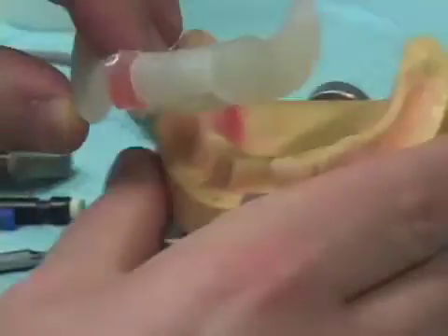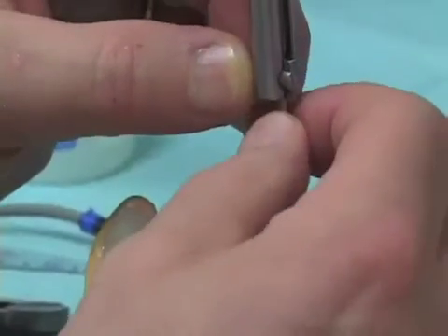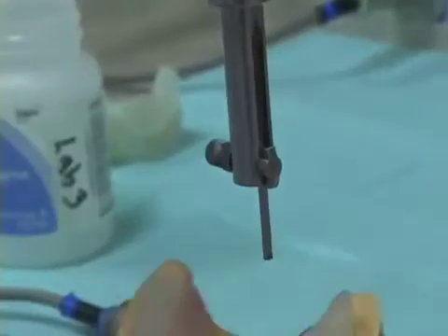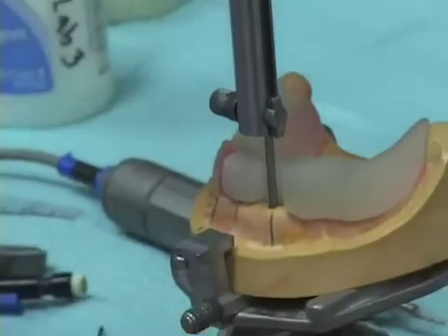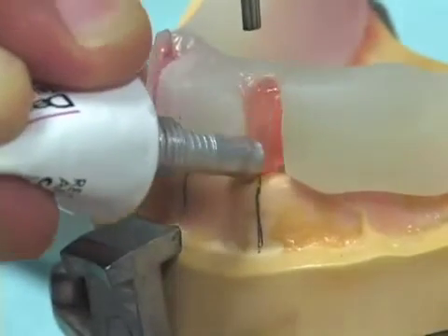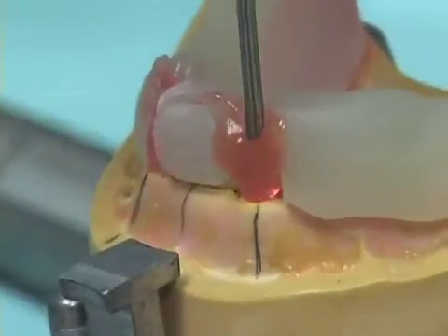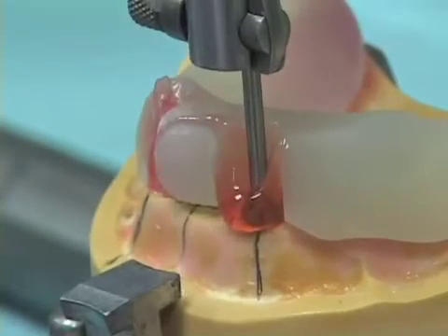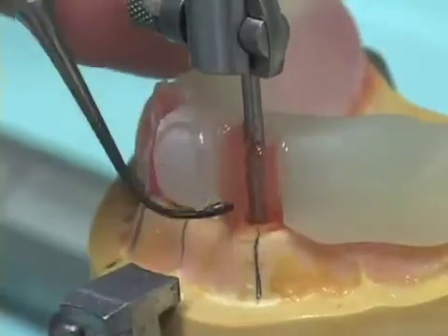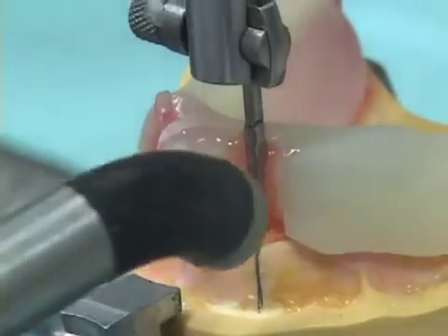So we're going to place our record base, which is going to become our drill guide, back on our cast, and put our 2.2 millimeter drill blank back in the vertical spindle of the surveyor. Again, position it exactly over the spot where we want our implant placed. Lift it straight up in the air. Triad gel in the space. Lower the vertical spindle straight down and use the large P.K. Thomas instrument to coax or tease the triad gel back up around the drill blank. And we're now going to proceed to cure this 20 seconds each side.